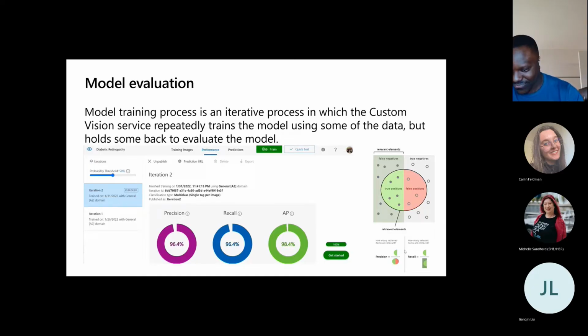And so that's just an example from Wikipedia that I had in explaining recall, and I put this little visualization just to help understand the two. They work together to give you an average precision, which accounts for both precision and recall. And so we'll use these metrics to see whether your model is good enough, or maybe you may need to train a bit more.